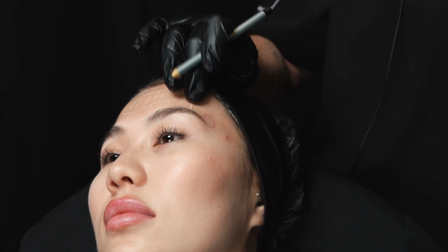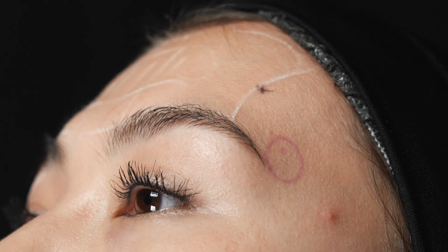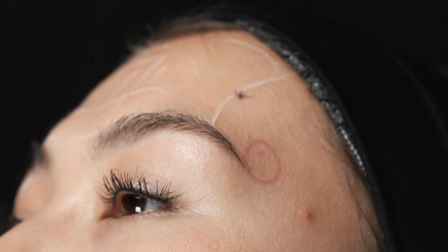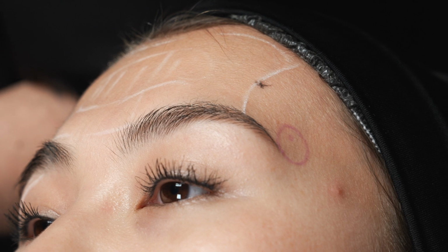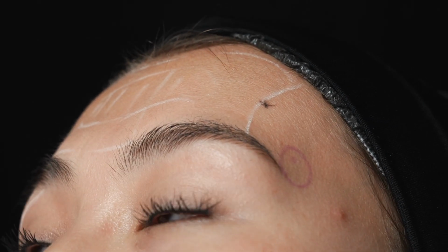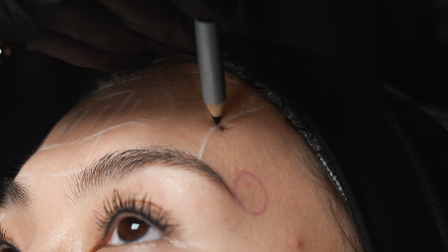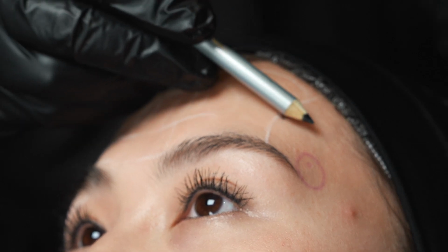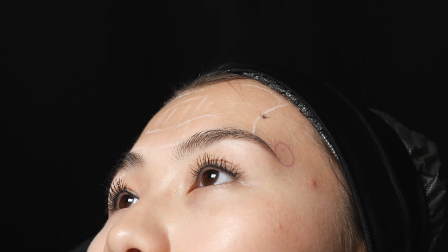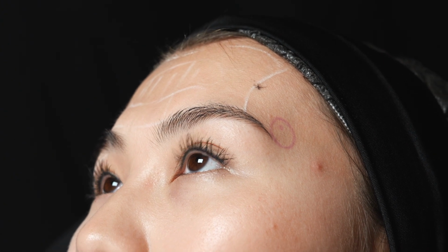в формате интрафасциальном. То есть, если я хочу интрафасциально сделать, то достаточно легко зайти вот из этой точки. Почему? Потому что я хочу быть внутри фасции, то есть между фасциями, внутренней и внешней. Я знаю, что фронтальная мышца продолжается в поверхностной фасции, поэтому здесь легче работать. Если я сюда зайду и дойду до кости, то тогда я могу зайти далее канюлей и изменить направление. И я знаю на 100%, что я нахожусь между двумя слоями. И канюля, если она находится между этими двумя фасциями, может спокойно скользить между этими слоями.